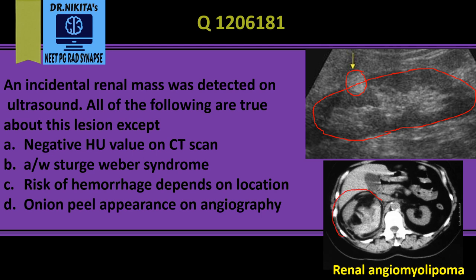On CT scan, this is the right kidney and that's the left kidney. In the right kidney we see this mass which has black areas. Black on CT is either air or fat — here it is a dirty black, so it is fat, consistent with the lipoma component of angiomyolipoma.